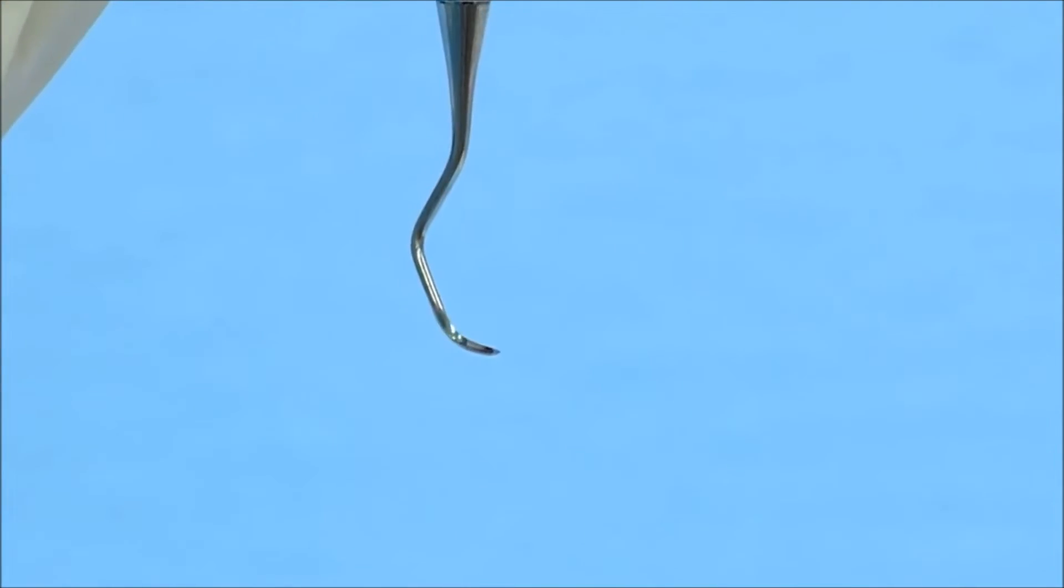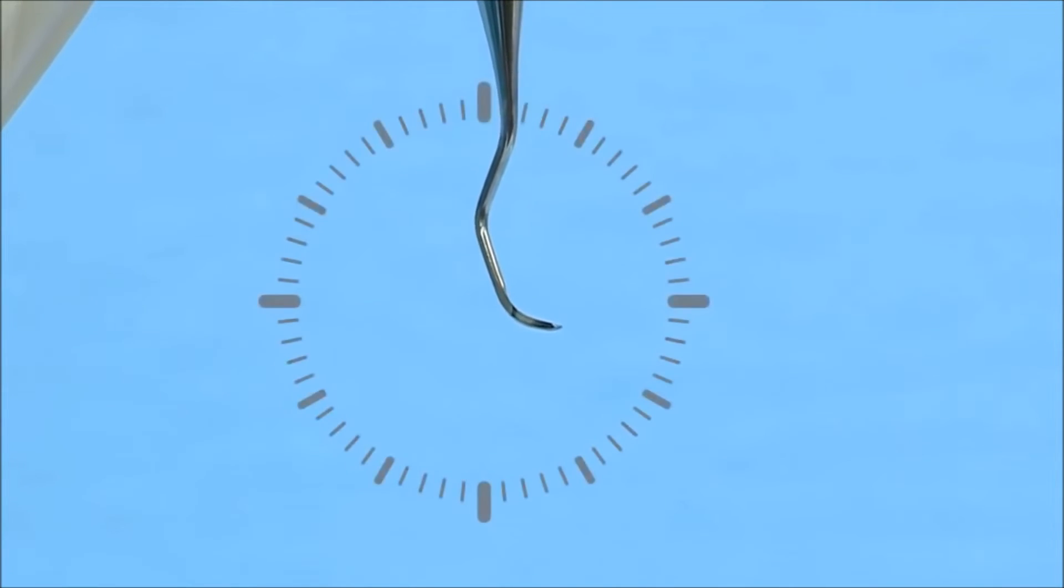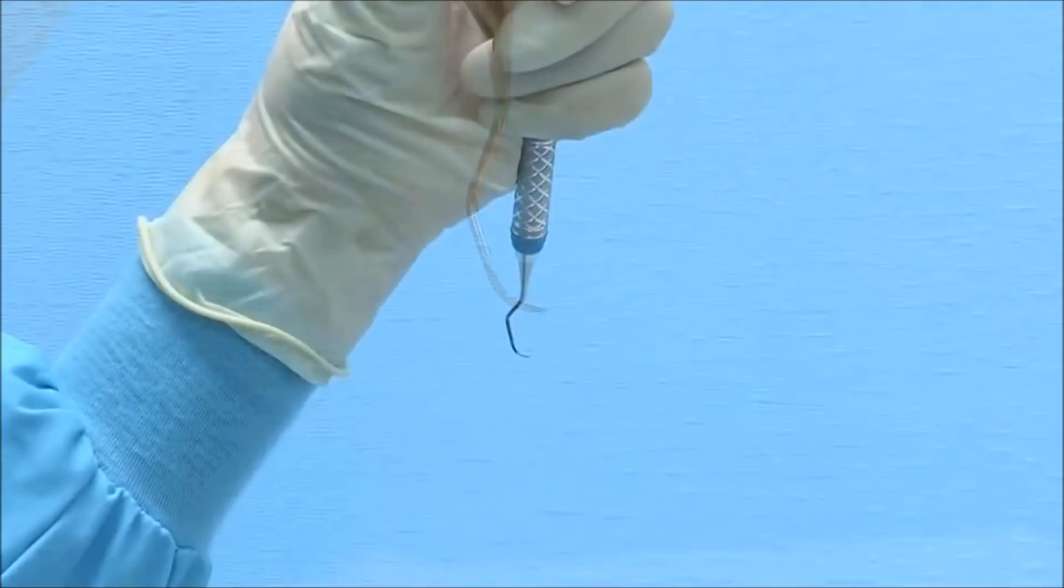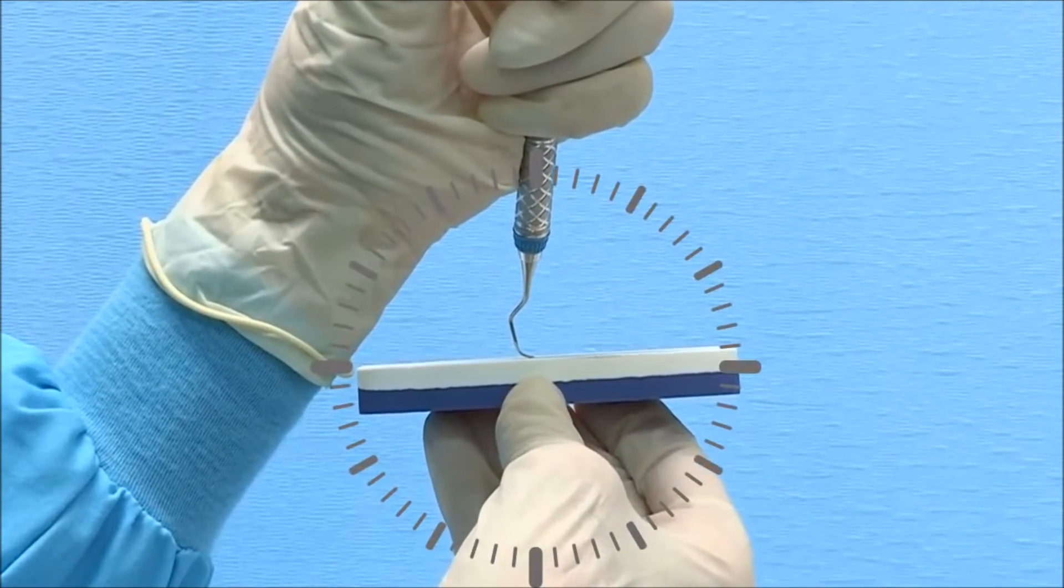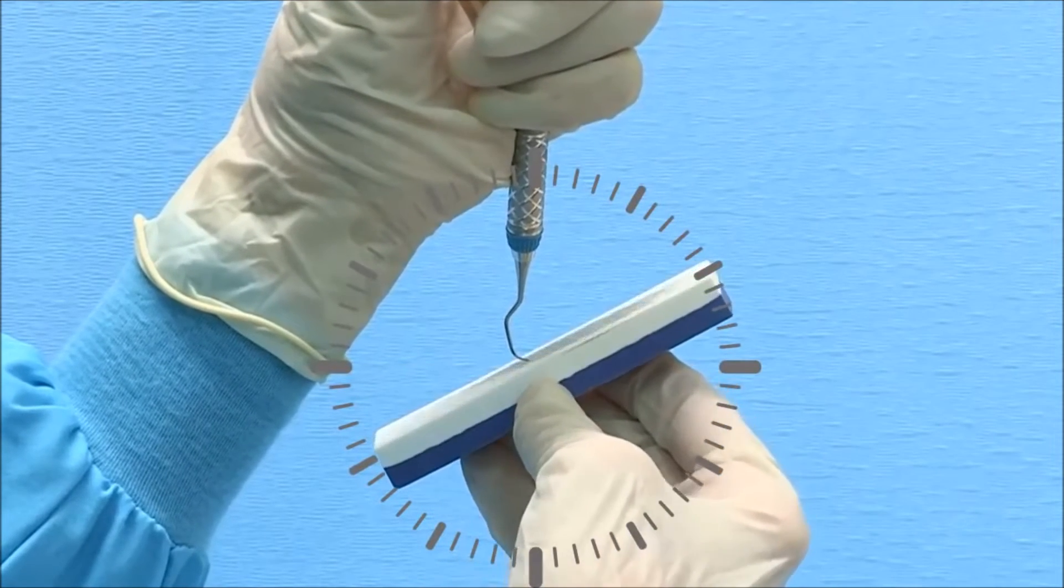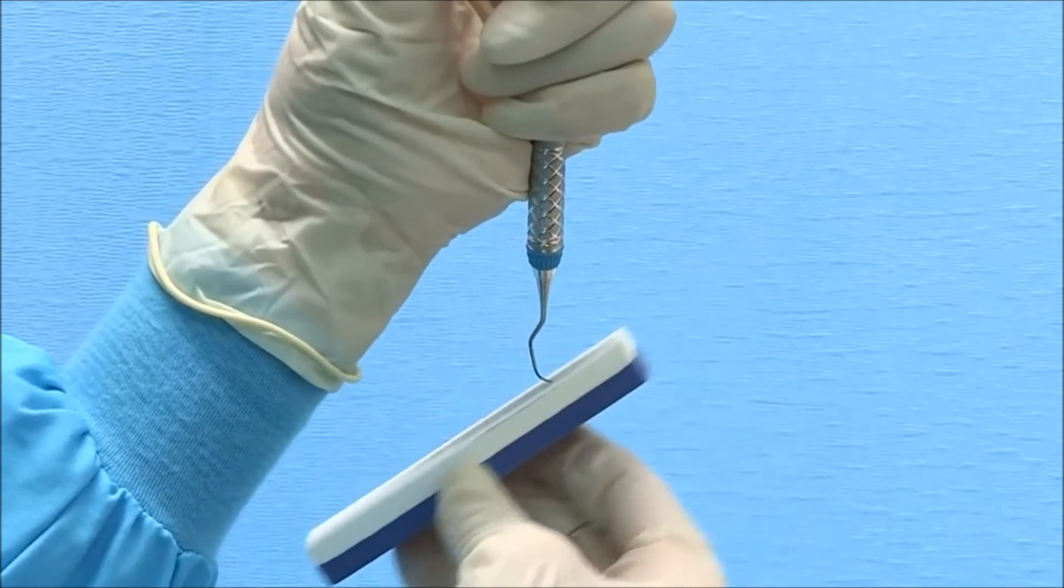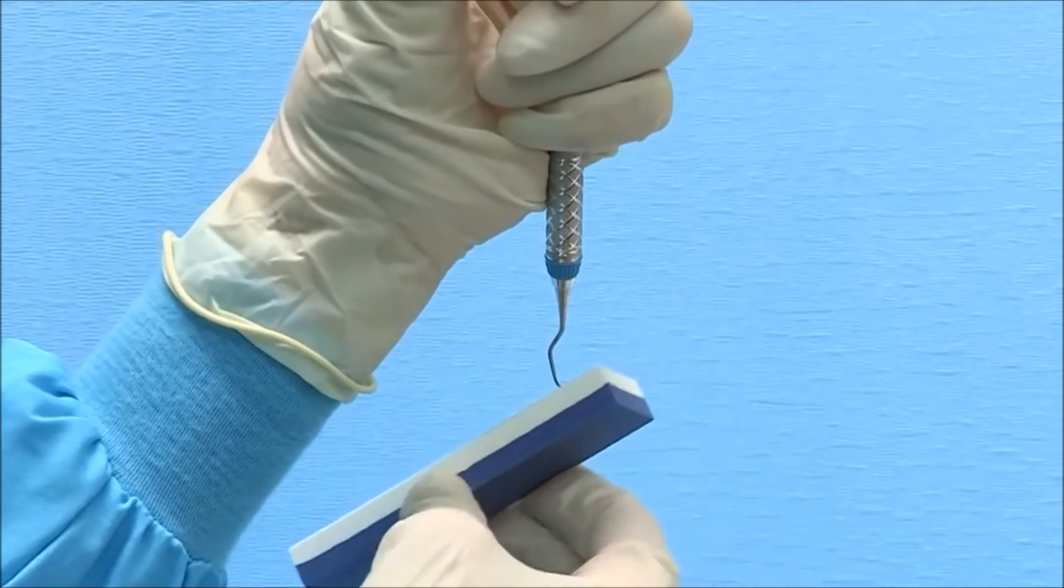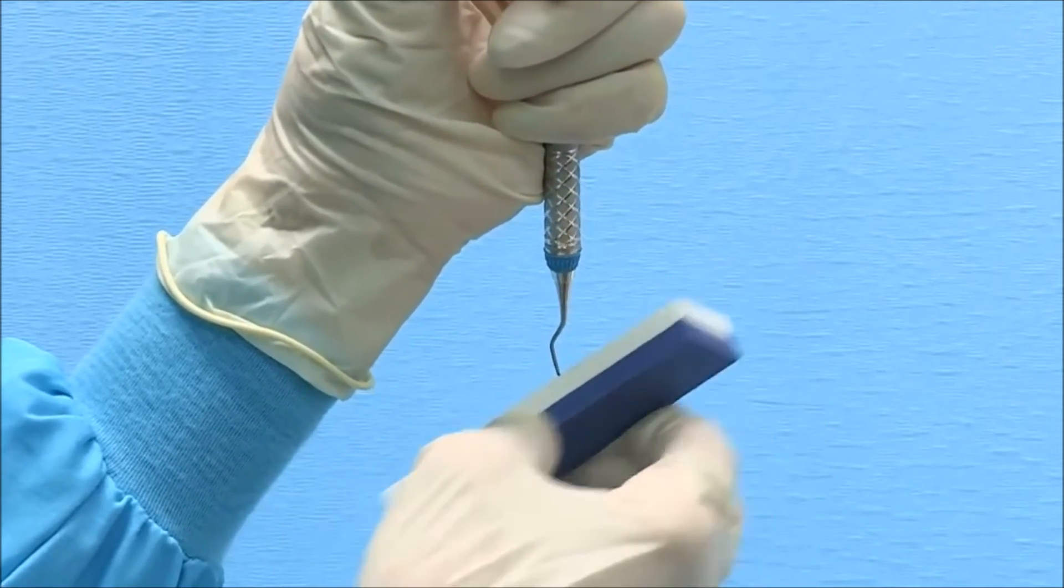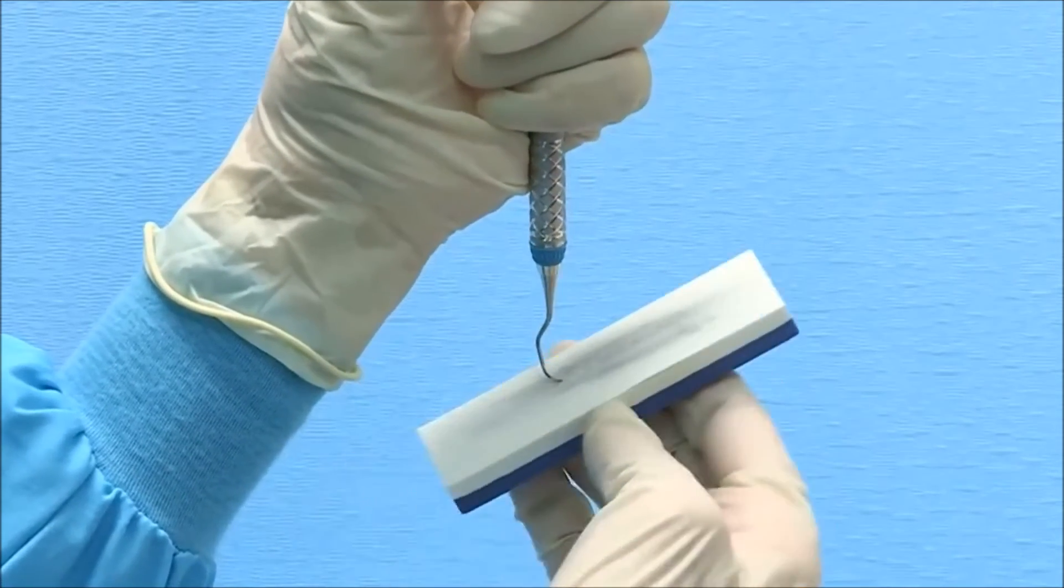To maintain the rounded shape of the curette toe, rotate the instrument handle so that the toe is pointed at 3 o'clock. Position the stone underneath the blade at 3 o'clock and tilt upward toward the 2 o'clock position. Move the stone in a consistent up and down motion, overlapping strokes and rotating around the toe to maintain the rounded shape.